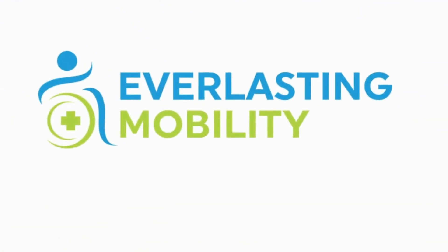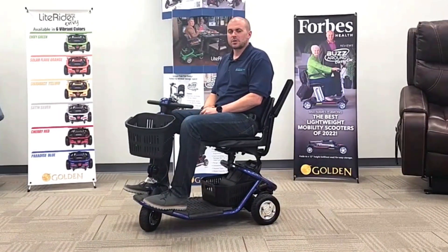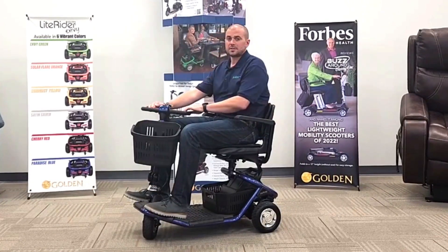Hi, this is Kel from Everlasting Mobility. Today we're visiting Golden Technologies corporate headquarters and in this video we're going to go over the LiteRider three-wheel mobility scooter. It's model number GL111D. So let's get into it.